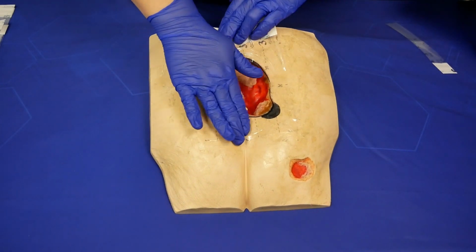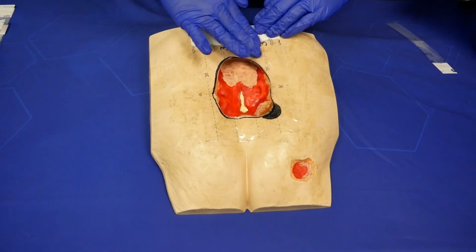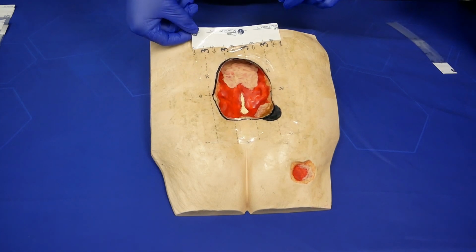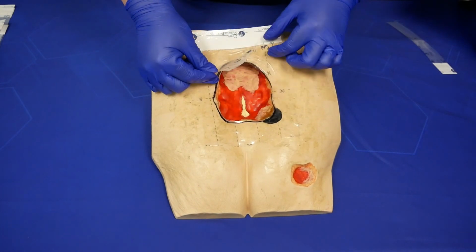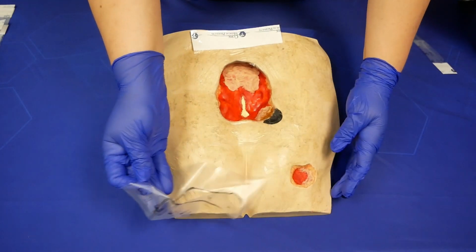And again, I just like to work my way around that tape to make sure it's nice and adhered onto that skin prep barrier that we've already laid down. And now we have to remove this top strip with the number 3. So I like to take my corner and I'll pop this up, and it makes this top part stand up so I can peel it down easily. And so I would just peel it straight down like that.